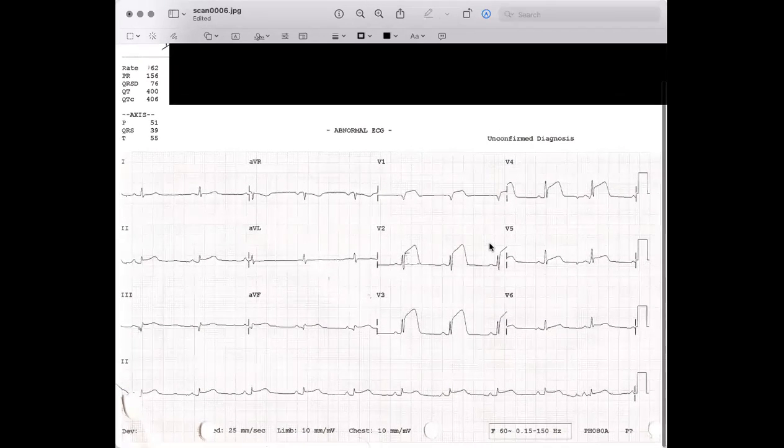Then after you did that, I will compare if there is any previous ECG. Excellent. Very good. That's what I want you to get out of this session today: the method, the systematic way. The abnormalities of each, we're going to go over in different subsequent sessions.